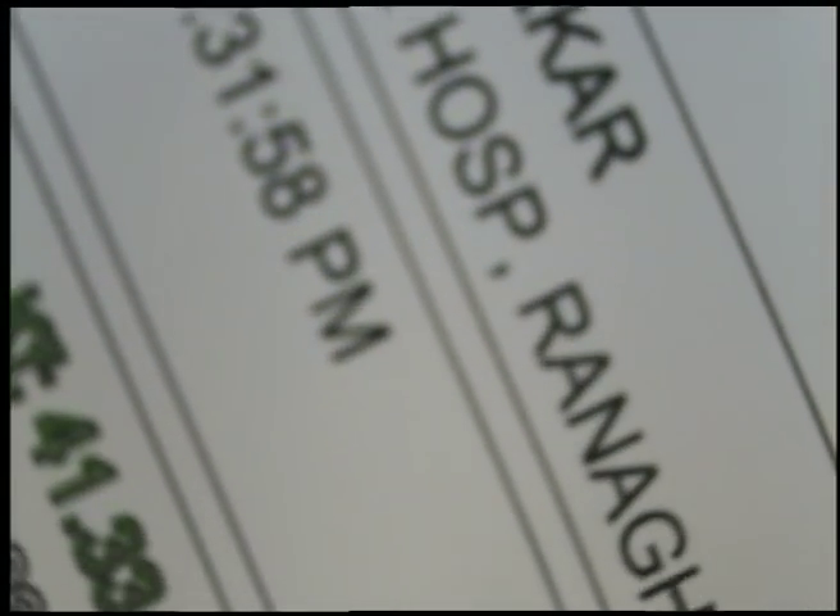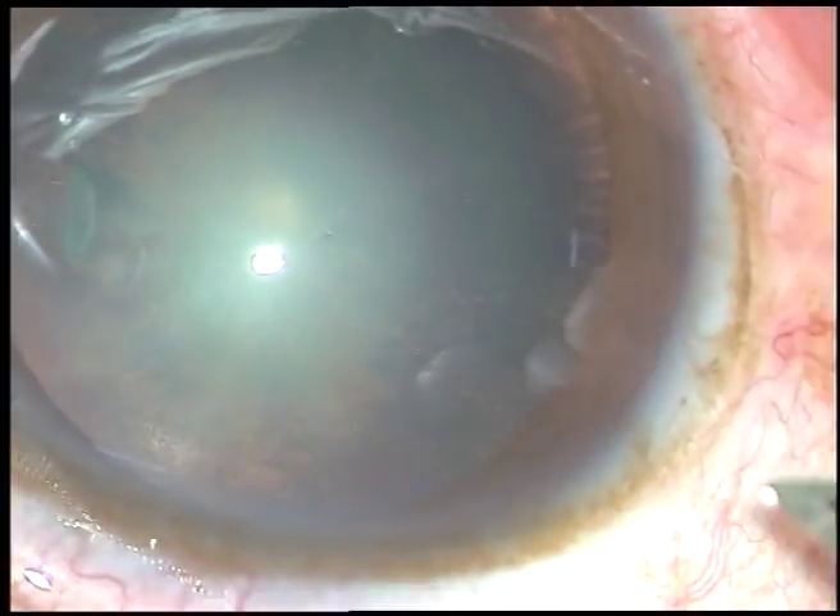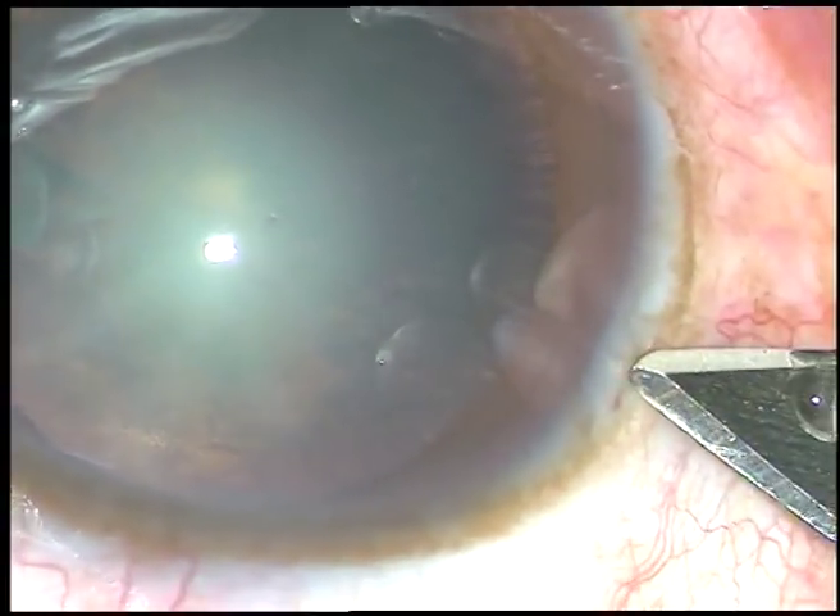Dear colleagues, this is a corneal topography assisted cataract surgery. The patient has 1.58 diopters of astigmatism and the steep axis is at 179 degrees. This is the corneal topography reading — 1.58 diopters is the astigmatism against the rule.